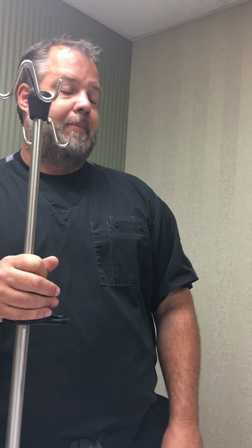Yes. And then eventually what's going to happen is it's going to say memory full. So then you have to start deleting. It'll do first in, first out. So number 41's gonna kick out number 1, and 42's gonna kick out 2.